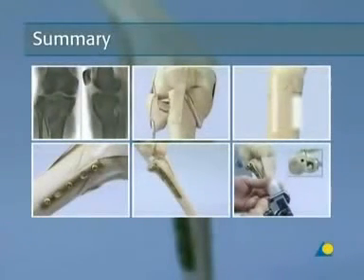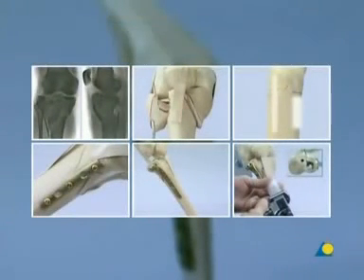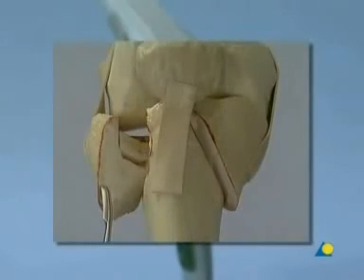Summary. This presentation has shown how to achieve stable fixation of a complex type C fracture of the proximal tibia. The critical points for success include accurate imaging and meticulous pre-operative planning to ensure that the fracture anatomy is clearly understood.